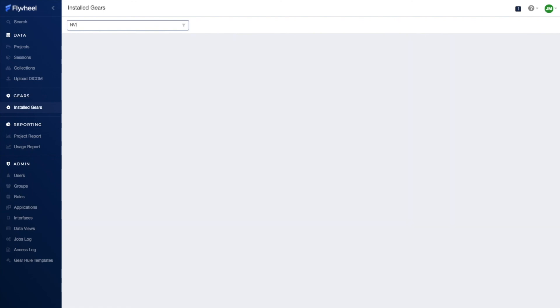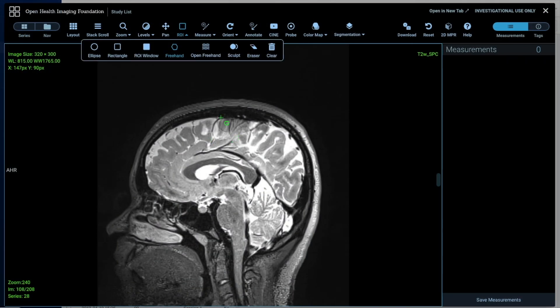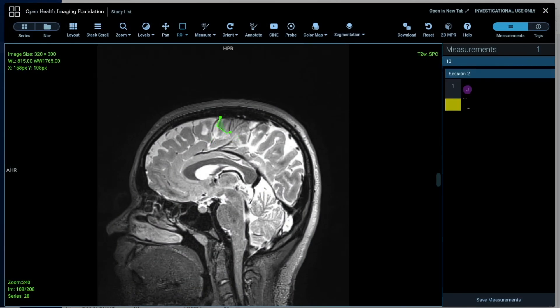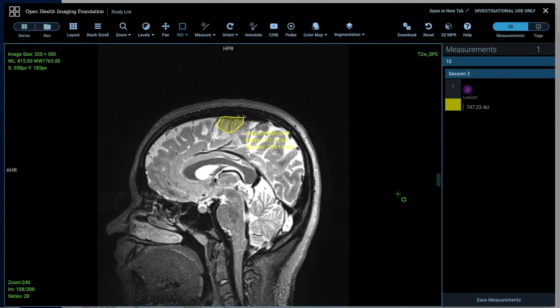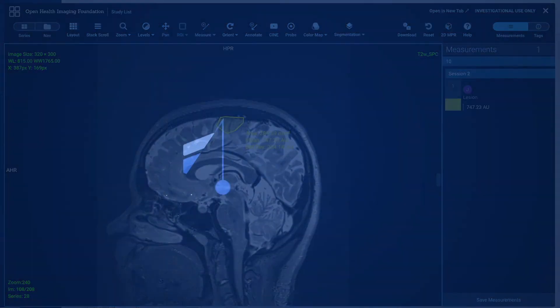Flywheel offers a number of additional curation tools, including annotation and labeling through our viewer. These tools are highly customizable and can be tailored to support a variety of machine learning workflows.